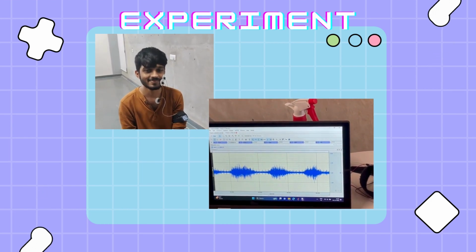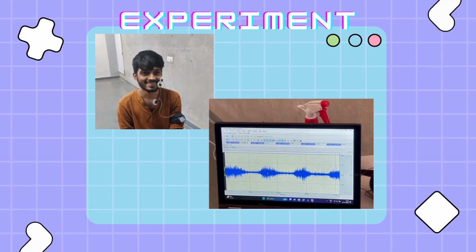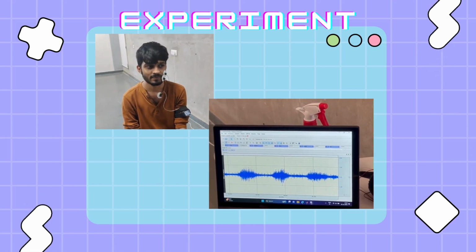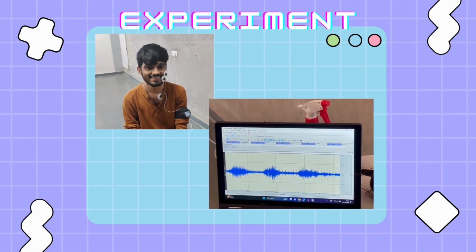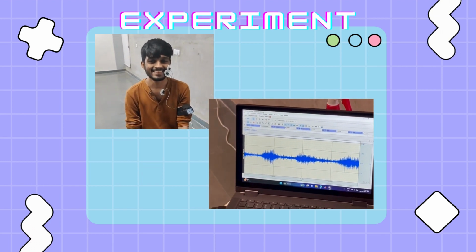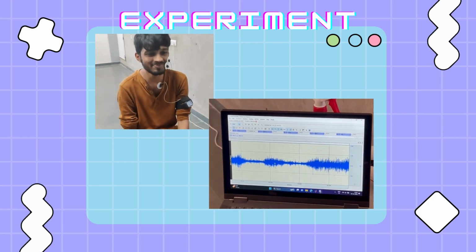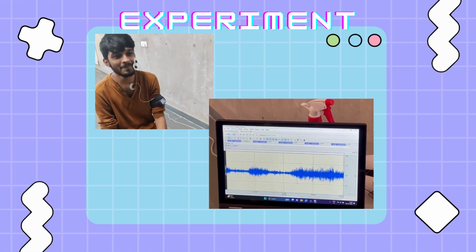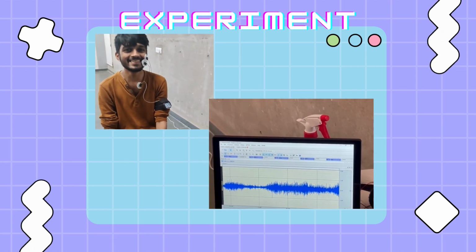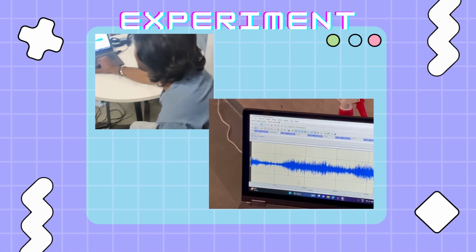Relax. Smile again. Relax. Now smile again and hold it as much as you can. Okay, relax, fine. Do one more time this one. Leave it. Okay, done. So this is the portion where he is.